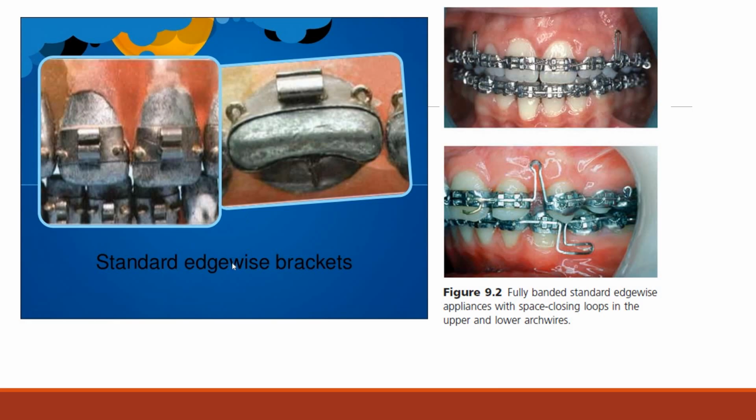This is standard edgewise brackets, fully banded standard edgewise appliances with space-closing loops in the upper and lower archwires. By activating these loops, the doctors previously closed the empty space after extraction.